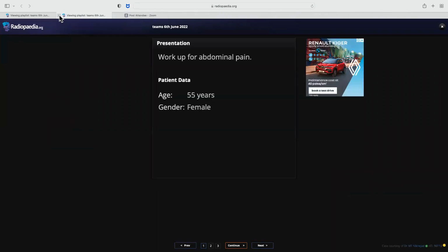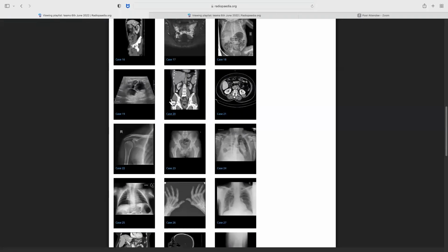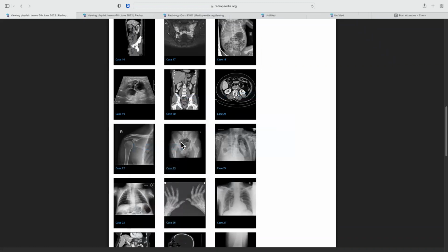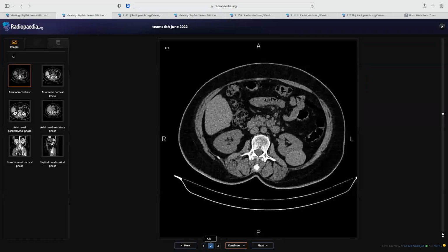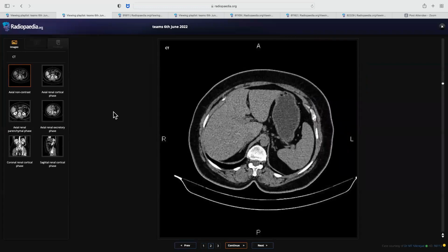Now, Dr. Iman. Yes. Yeah, hello, Dr. Iman. Hello. Work up for abdominal pain, 55. Do you want me to scroll or will you scroll? I can try. Just give me a second.